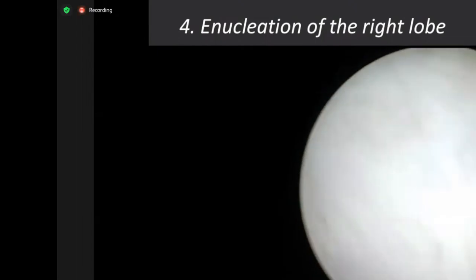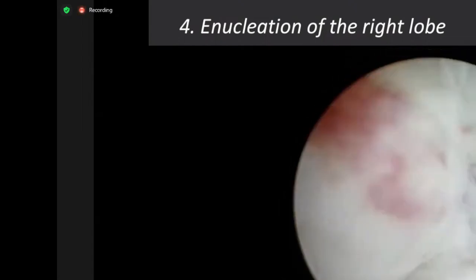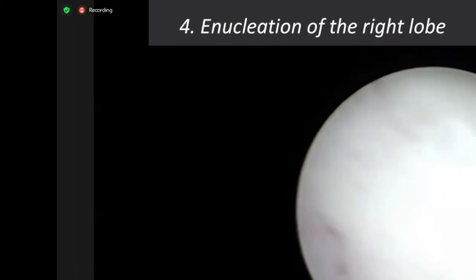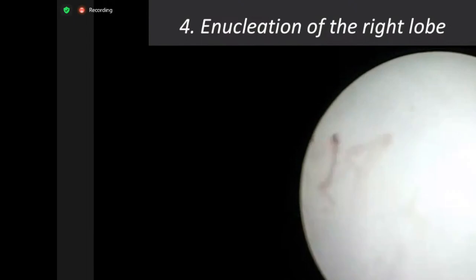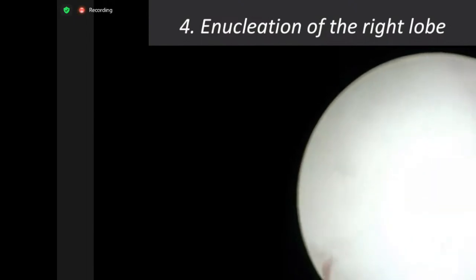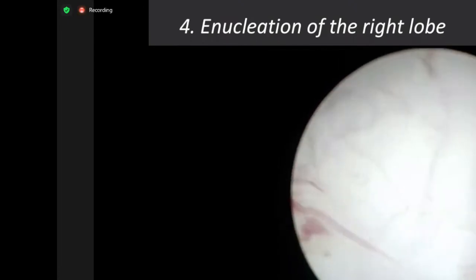For the right lobe, I won't get into the bladder neck right away because I believe I already defined the bladder neck on the right side. So I will go from there. If you see adenoma just now, like what you see just now, then again, you go back a bit, you go more lateral until you reach the correct plane.